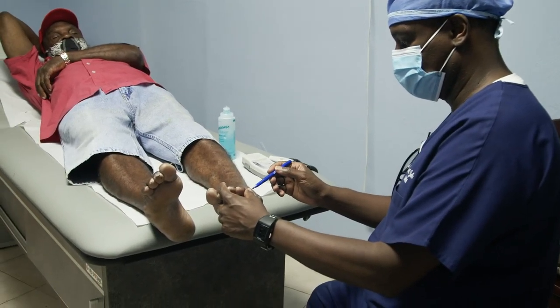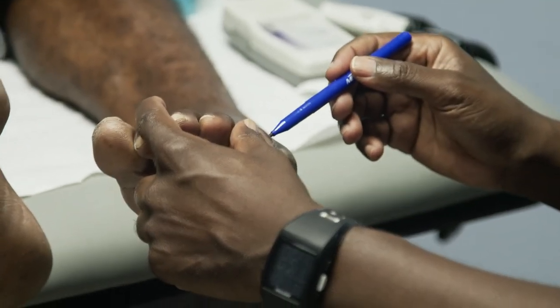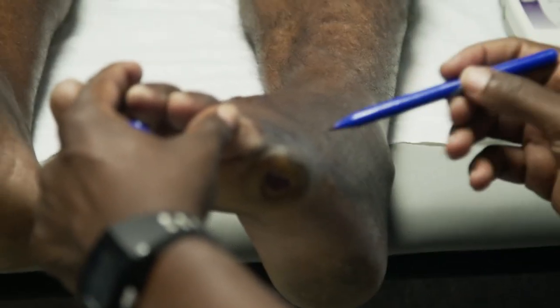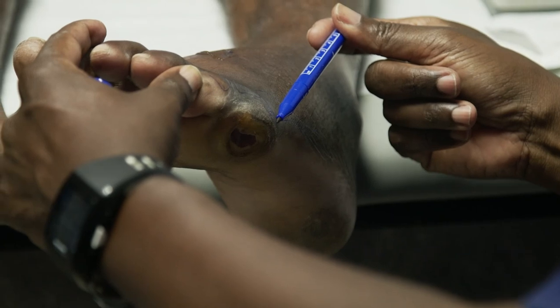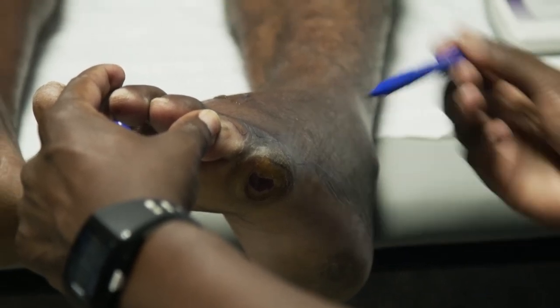Okay, so this is the toe, so I'm looking at the bony setup. That's one bone, that's the next bone that comes there. His metatarsal head is going to be like that, okay? So this is the part, and that angle there is the force of pressure keeping this wound going, and that's the angle we wish to change.